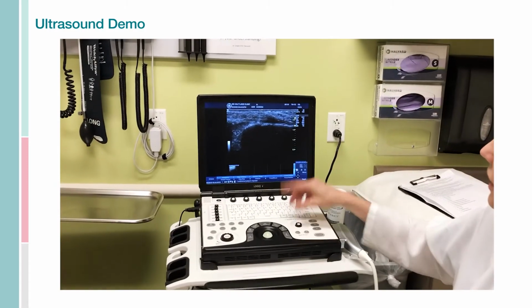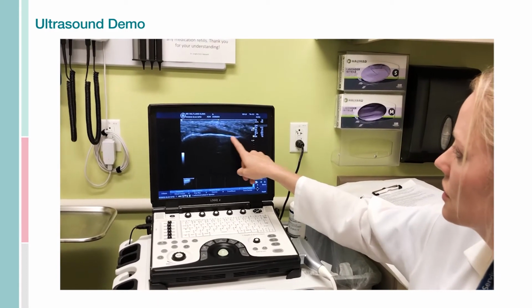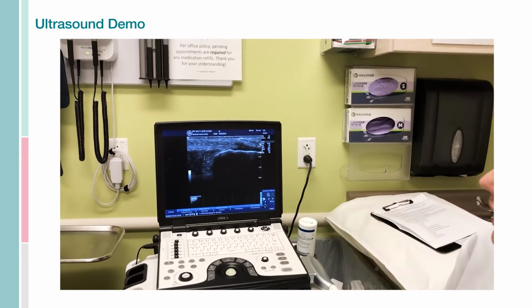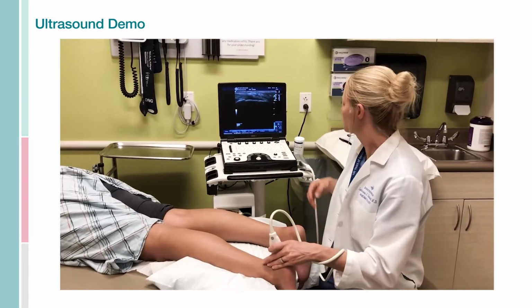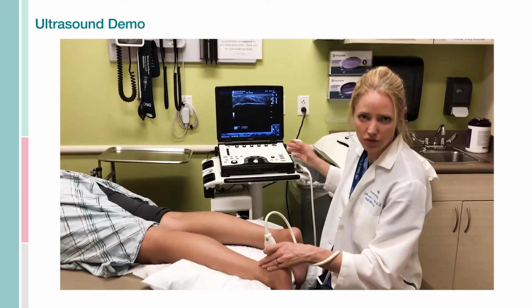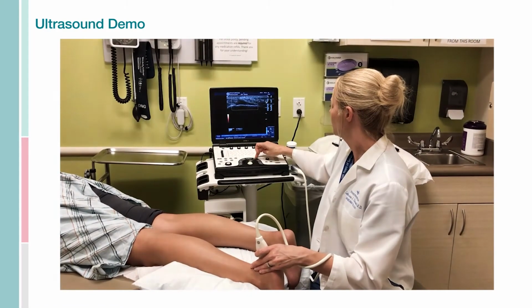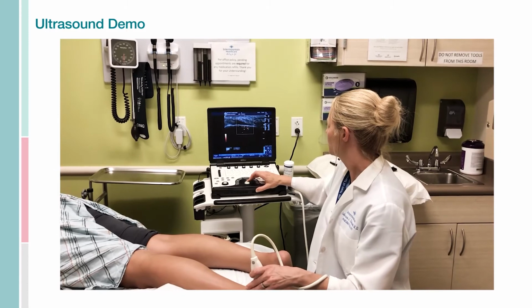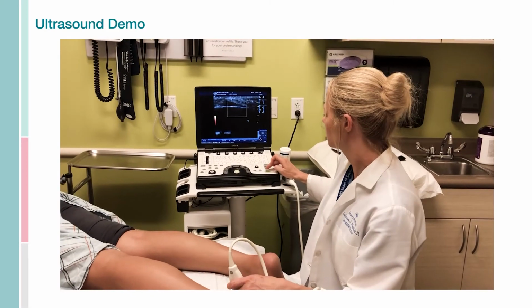Here again, I've changed my machine settings to ankle. And what I'm looking for here are enthesophytes at the distal calcaneus, the distal insertion of the Achilles, and oftentimes erosions are seen here more proximally. This would be the region of a retrocalcaneal bursitis if present, and then you can relax down again. Once you are satisfied that you have examined thoroughly throughout the enthesis medially and laterally, capture a representative image, then you can turn on Doppler signal. Make the region of interest box a little bit more narrow, but make sure to scan through the entire enthesis medially and laterally. Saving again a representative image.